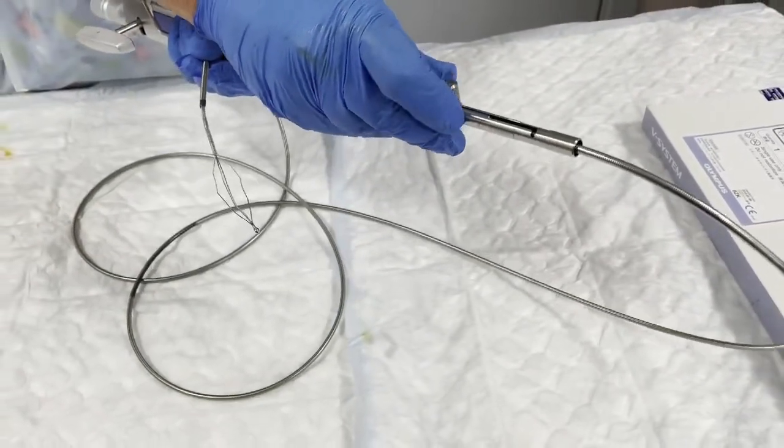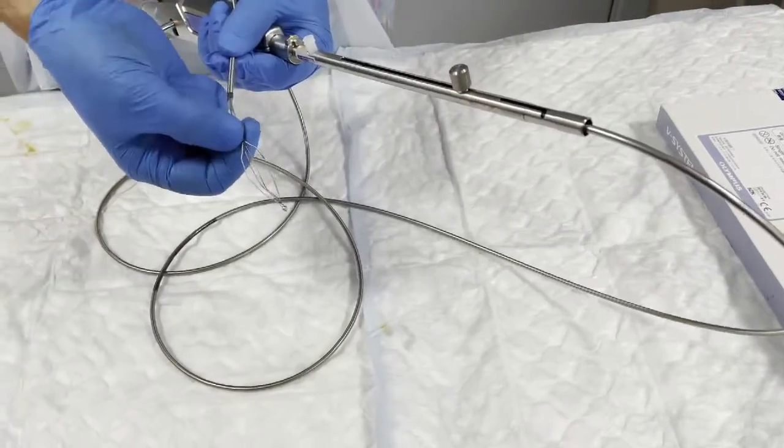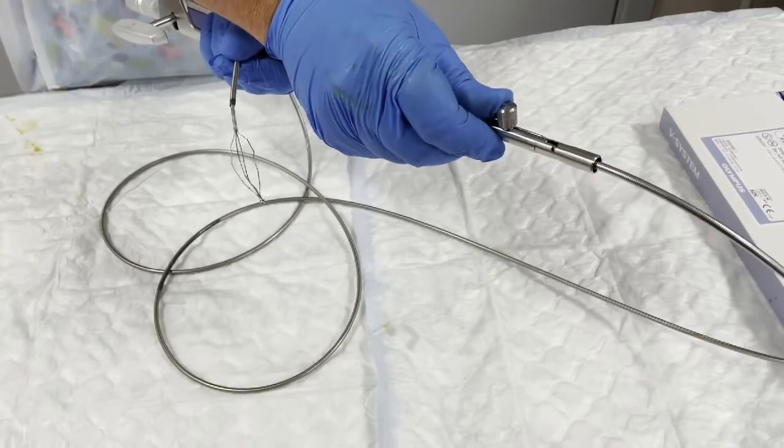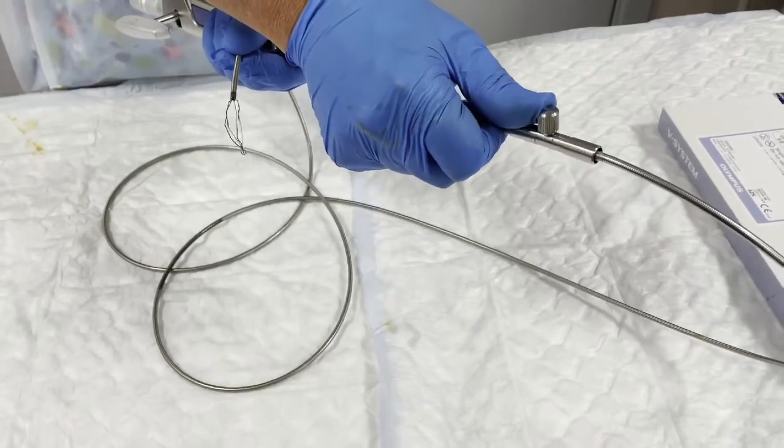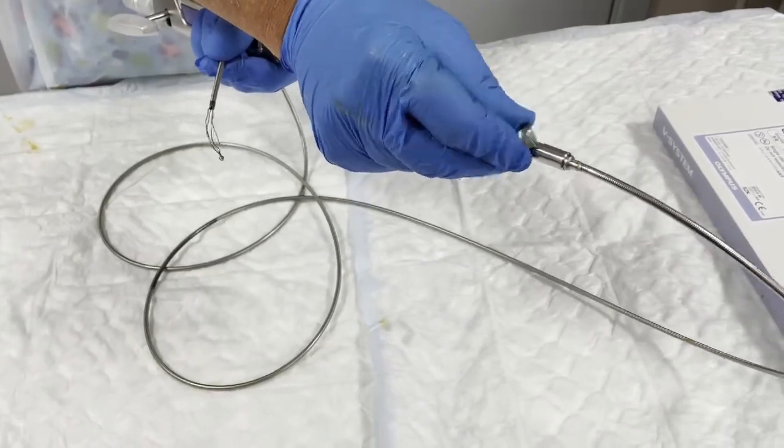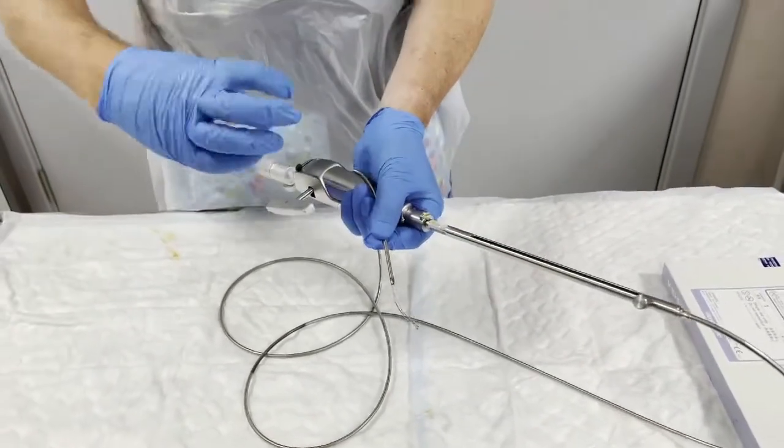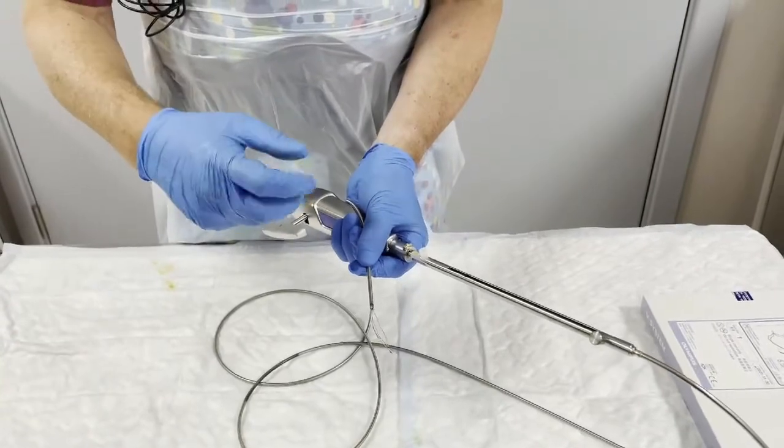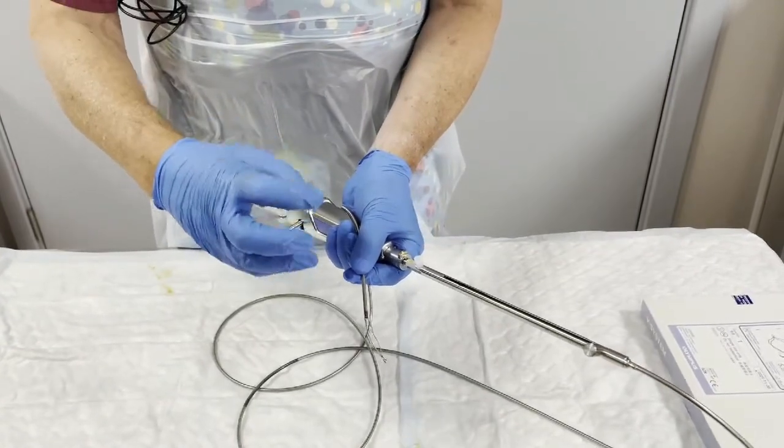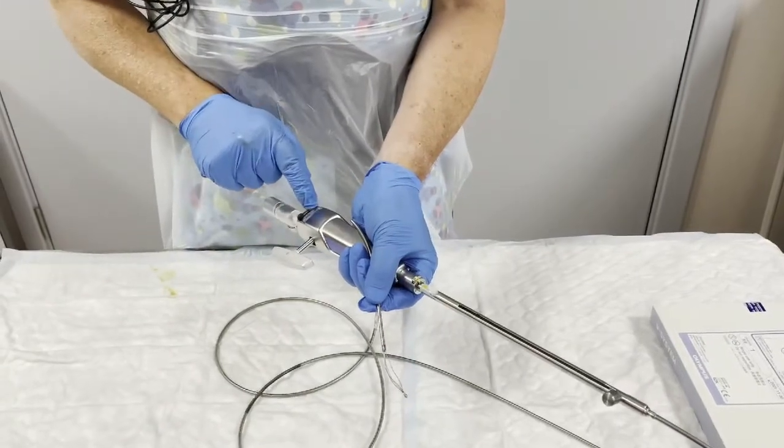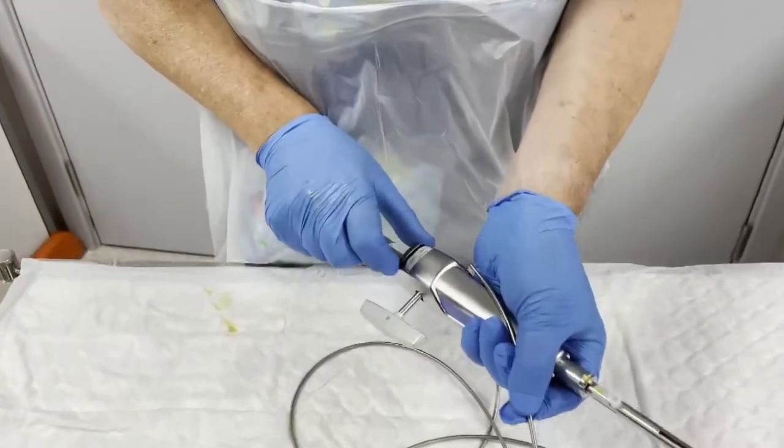And you can see that as we do this, the sheath is advancing up to the basket. So we advance this sheath up to that point, and then we lock it here, and we just lightly tighten it there. That is now locked, and then we will be in a position to perform lithotripsy and crush the stone. To do that, we need to turn the ratchet to the on position.